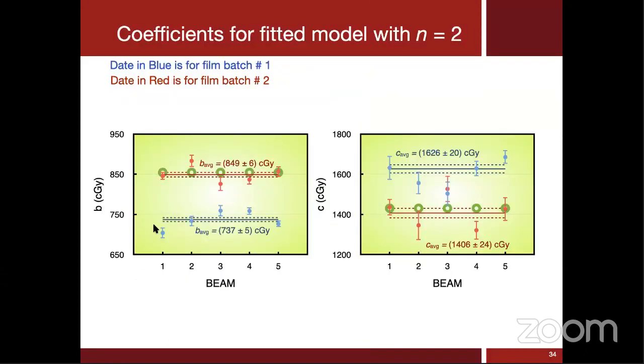So this is, for example, one result of the fitting when N was equal to 2. This represents the calibration parameters obtained by fitting data from, let's say, 6 MV. This is from 10, 15, and 18, and so on. Because the parameters are roughly constant, one could say, look, probably these films are really energy independent. This is for, I think, 2 batches.